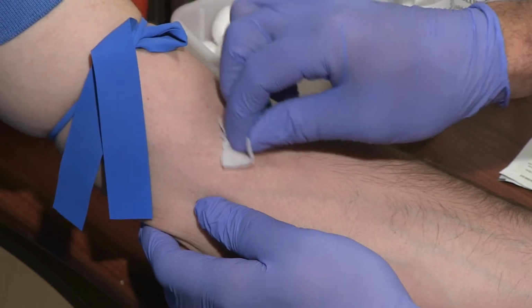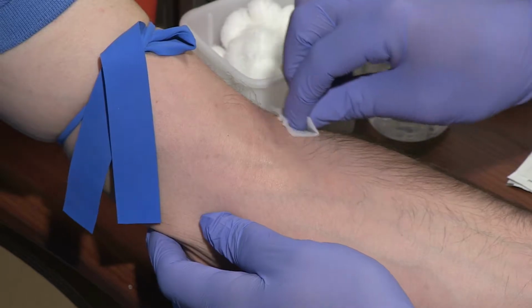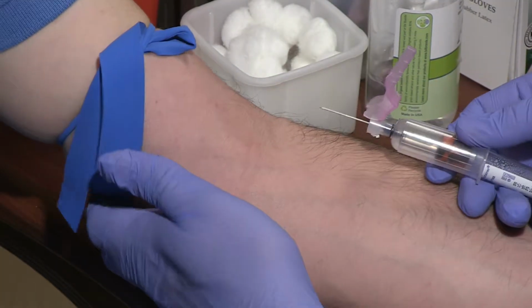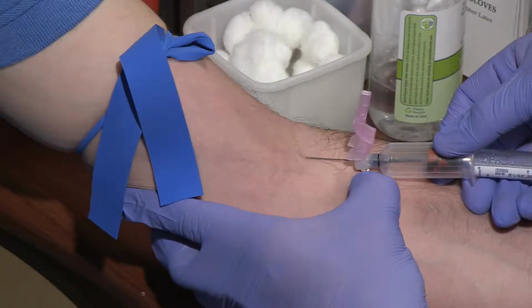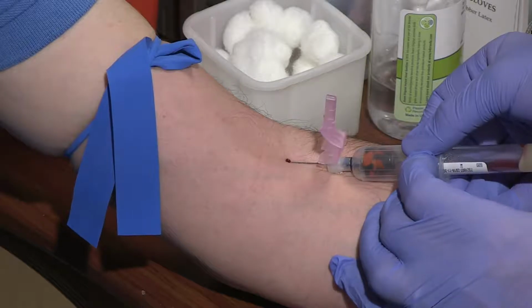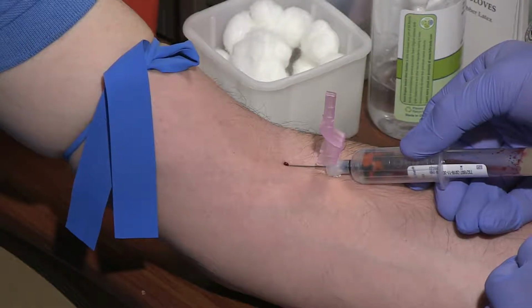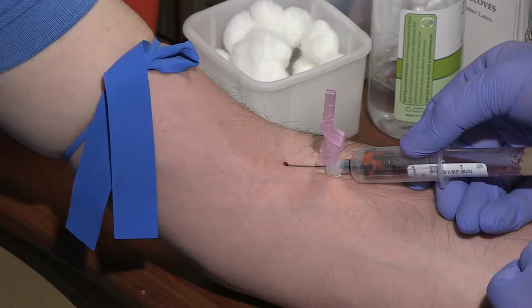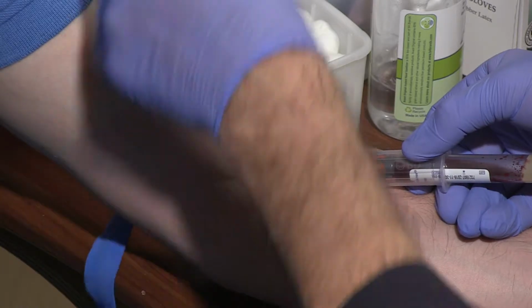Once the vein has been located by palpation, it is cleaned with an alcohol wipe in a circular fashion. After the vein is cleaned, it is punctured with a sterile needle. With the needle fully under the skin, the first tube is advanced onto the needle within the hub. If the blood is not immediately returned, the needle is advanced into the vein. If the needle is pulled out of the skin before blood is returned, the lab tube will lose its vacuum and must be discarded.